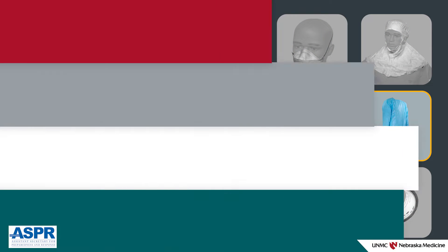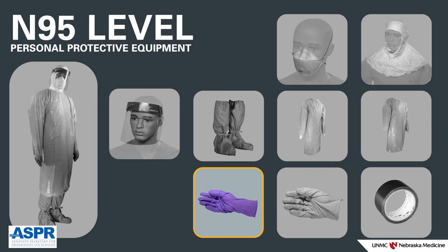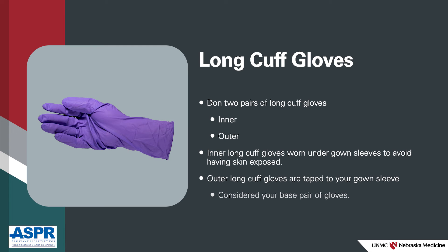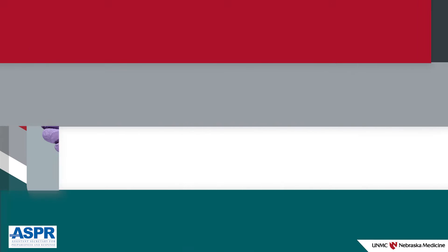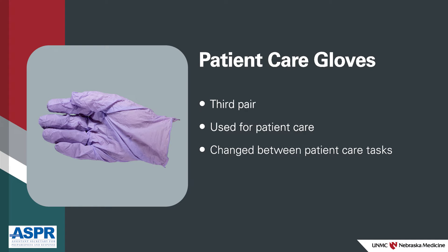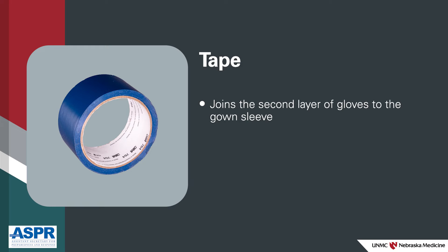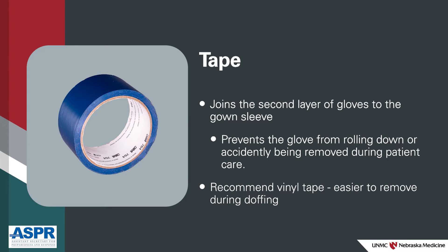Apron — an apron will provide protection in situations where gross soiling may occur. Long cuff gloves — N95-level PPE requires two pairs of long cuff gloves to be donned. The first layer are worn under your gown sleeves to avoid having your skin exposed. The second pair will be taped to your gown sleeve and are considered your base pair of gloves; they will not be changed during routine care. Gloves should be latex free. Standard patient care gloves — the third pair are used for patient care and should be changed between patient care tasks. Tape — the tape is used to join the second layer of gloves to the gown sleeve to prevent the glove from rolling down or accidentally being removed during patient care. We recommend vinyl tape as it's easier to remove during doffing.